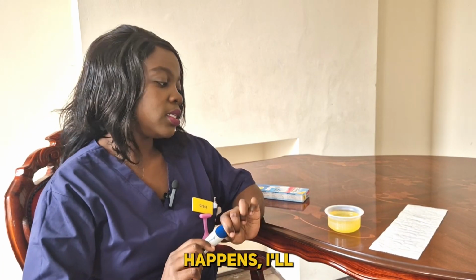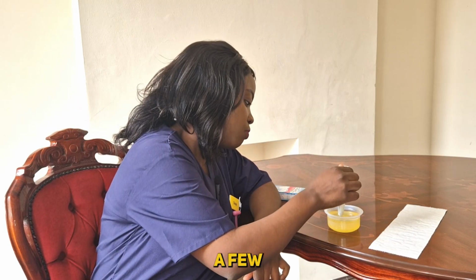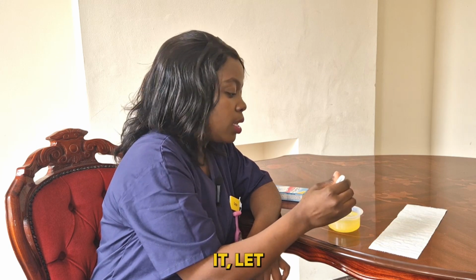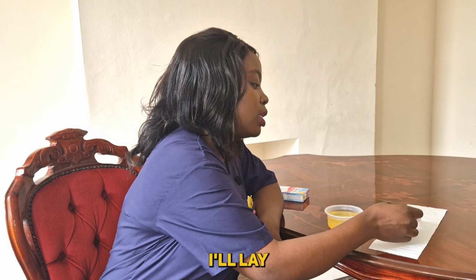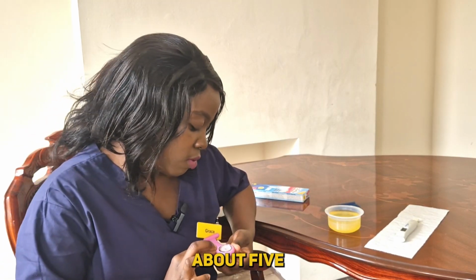So I've already collected my urine, it is there. What happens is I'll just open my test strip. Once I open my test strip, I'll be dipping it for a few seconds. 1, 2, 3, 4, 5, 6, 7, 8, 9, 10. I'll remove it, let it drip a little bit, then I'll lay it down on the paper. I'll let it lie there for about 5 minutes.